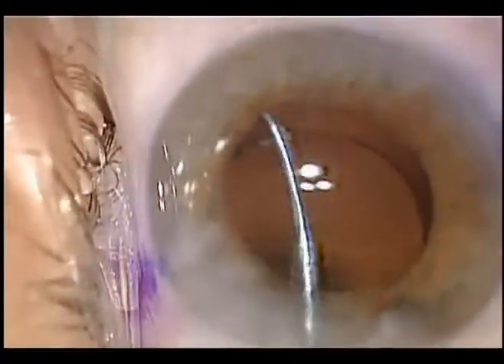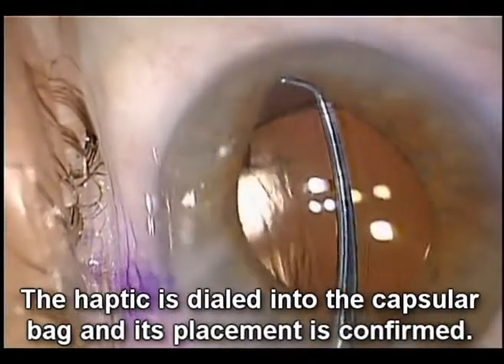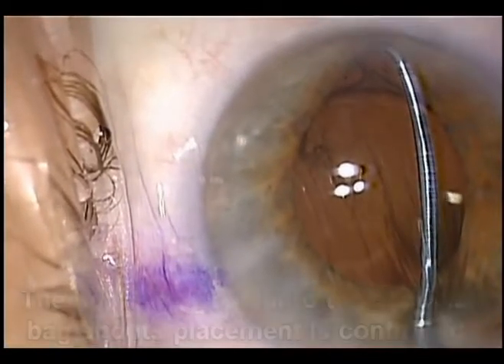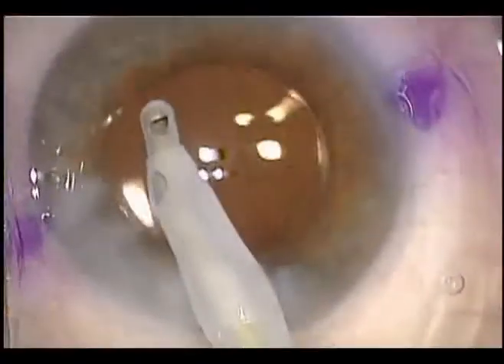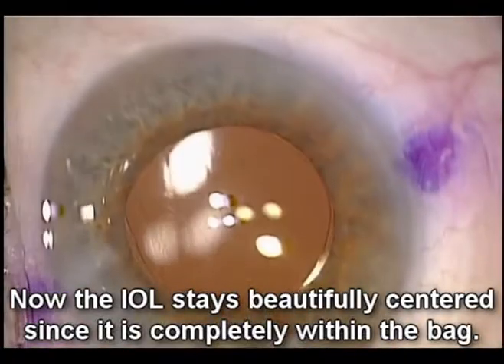We'll use our chopper to dial the lens fully into the capsular bag. Now both haptics and the optic are in the capsular bag, confirmed by direct visualization. Removing the viscoelastic now results in an eye with a beautifully centered IOL.